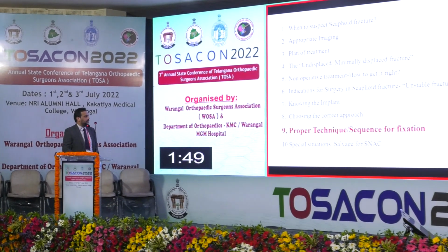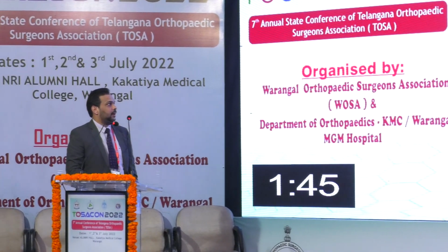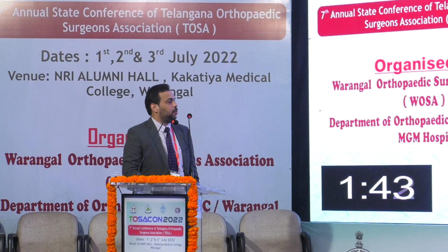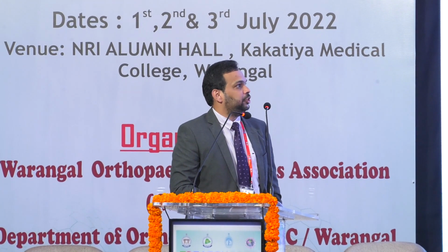Coming to proper technique and sequence of fixation. Implant placement, whichever way, has to be central and long enough. These two are the most important biomechanical parameters, which are supposed to be stable. And you have to visualize under fluoroscope. And always move the wrist after finishing your procedure to look for crepitus and proximal screw migration.